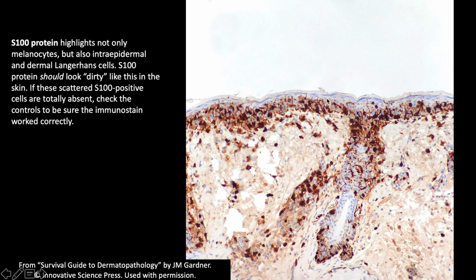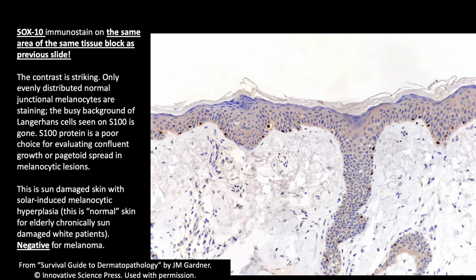It's going to scare you to death because you'll see all that stuff. Here's the same case, same area of the block, stained with SOX10. Look at the dramatic difference. That's why I like SOX10, okay? I don't make any money. I don't even know who all manufactures SOX10. I just use it in my practice, that's all. So I don't think I have any conflict of interest with those immunostain companies, to my knowledge. All right, so in any case, that's what I do.